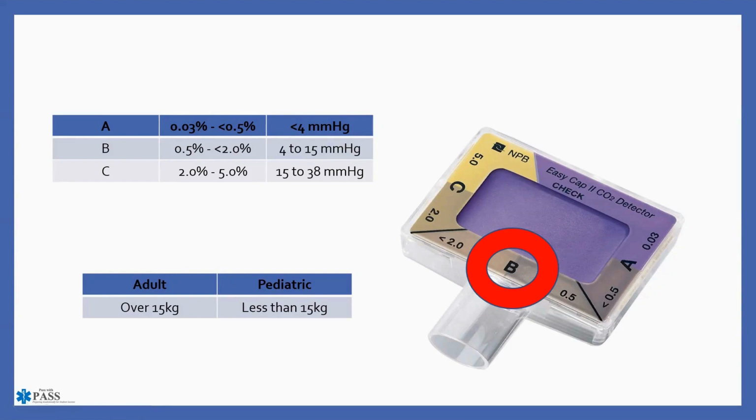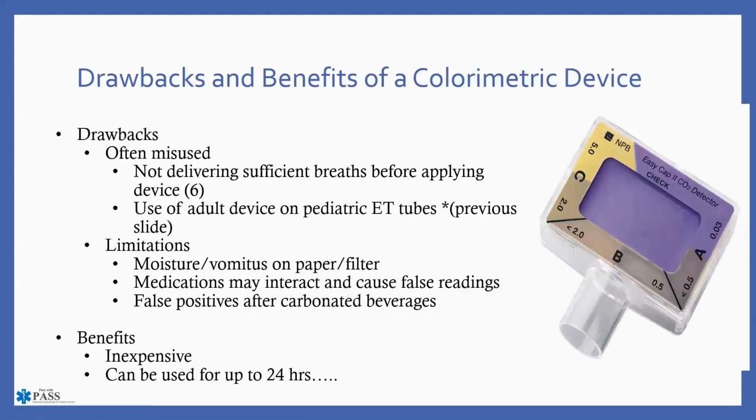There's some documented cases of this happening in the hospital setting, and then through some studies and information that they were looking at to determine if this does in fact happen. And the answer is yes. So only use the right size cap. It wouldn't probably be as problematic using a pediatric cap in the adult patient because we don't run the risk of making them hypercarbic, but certainly do not use the adult in the pediatric patient because you can have some untoward effects from that.